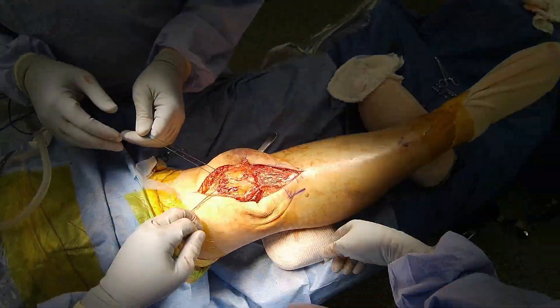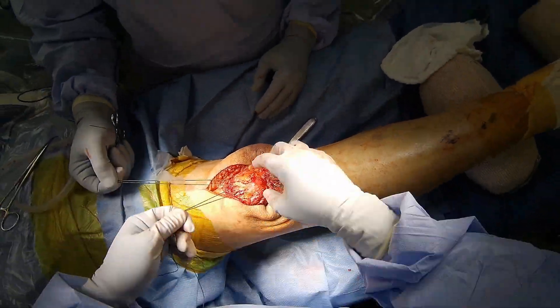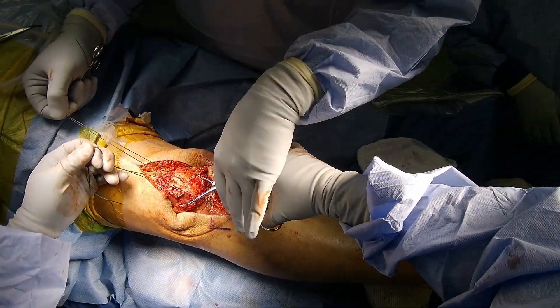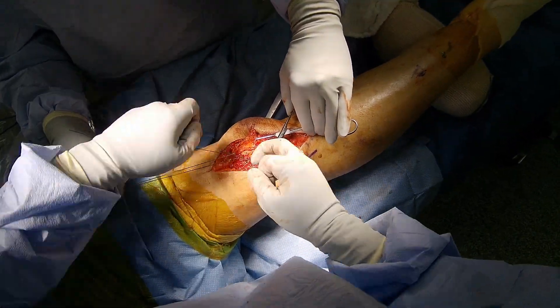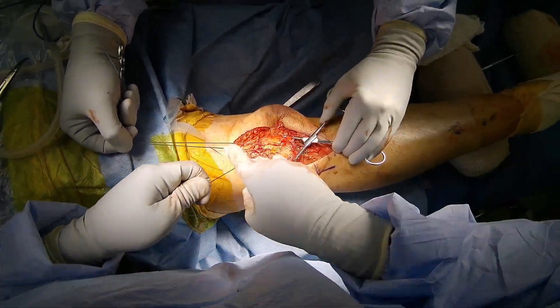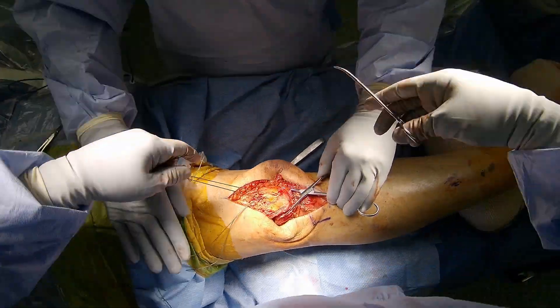Now it is time to tie the threads together. I check the sutures are paired correctly and maximally extend the knee by placing the ankle on a bump and letting the knee sag. I have my assistant use a bone tenaculum to pull the patella distal while I pull the tendon sutures proximal into the end of the prepared patella and tie tight knots. I then tie the other pair of sutures.